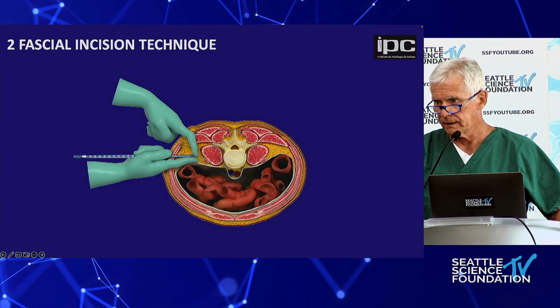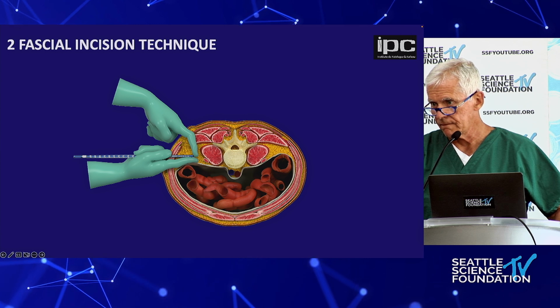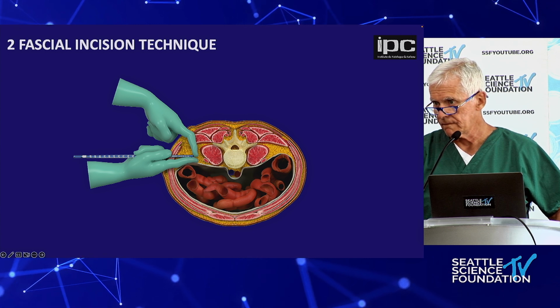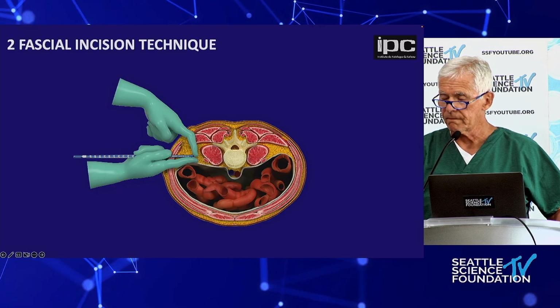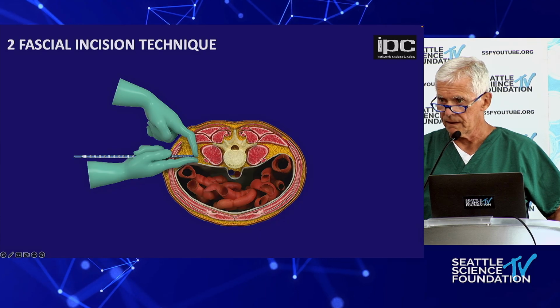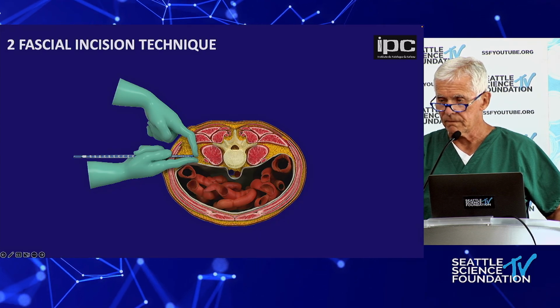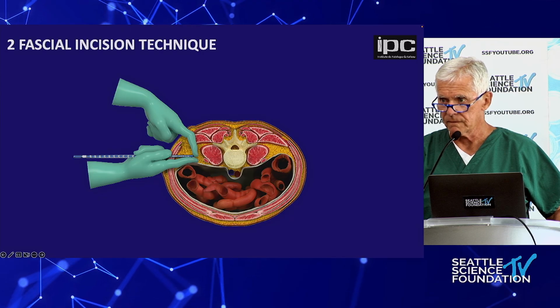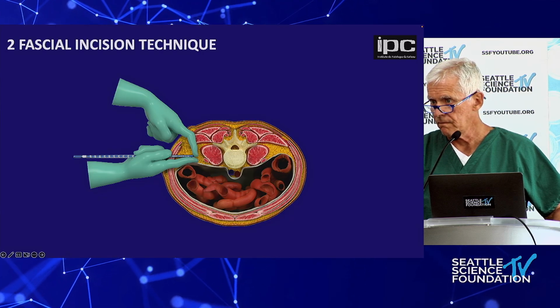I just wanted to add on Dr. Scullion's comment there. It is quite daunting when you first start doing prone transpsoas because the distance is greater, especially in obese patients. Your technique, which Dr. Taylor has a modification of that's very similar, using the perk incision, poking through lateral to the TP, helped me be very confident.